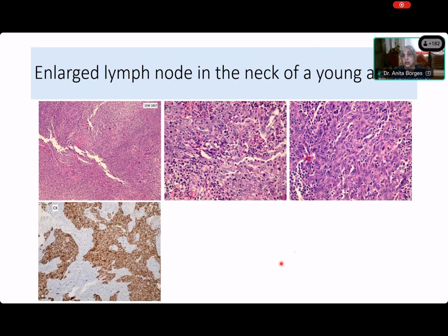Well, it's a carcinoma, right? So it is a carcinoma. And now we know that this poorly differentiated tumor is a carcinoma. It's malignant. There's no two ways about this. Now I have to figure out what this carcinoma is. So now tell me, Aishwarya, what should I do next?